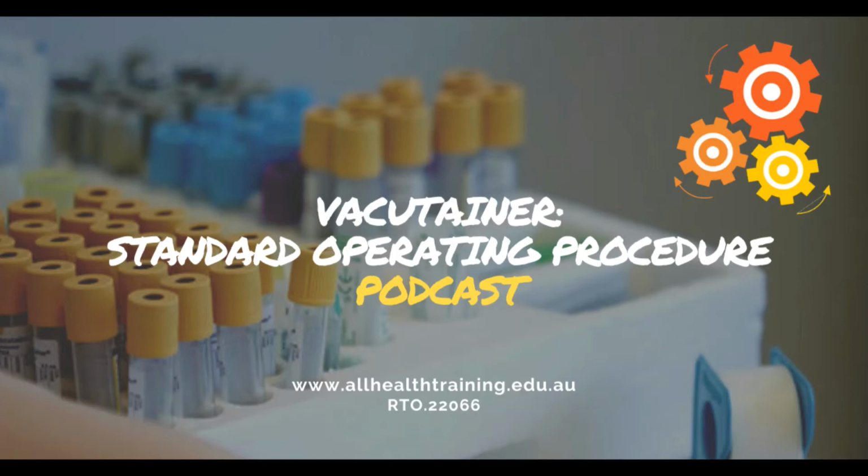Stand the barrel upright on your workstation. Remember, we never place the sharps into the kidney dish. Apply your gloves and place your dish on your non-dominant side within reach. This will be either on your workstation or asking the patient to hold this in their lap. Retighten the tourniquet.